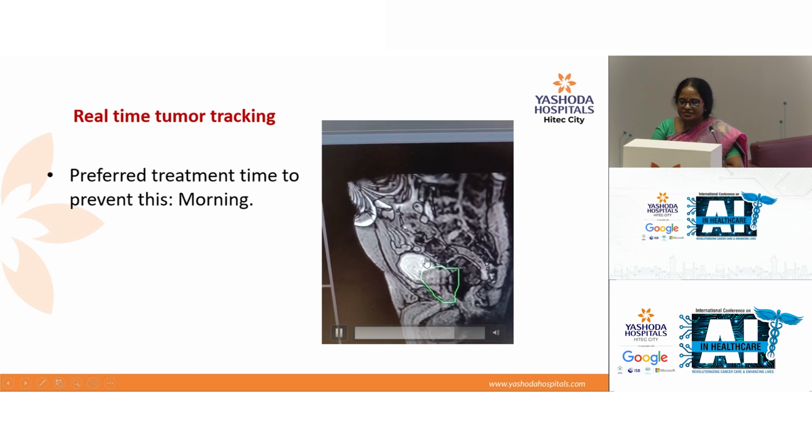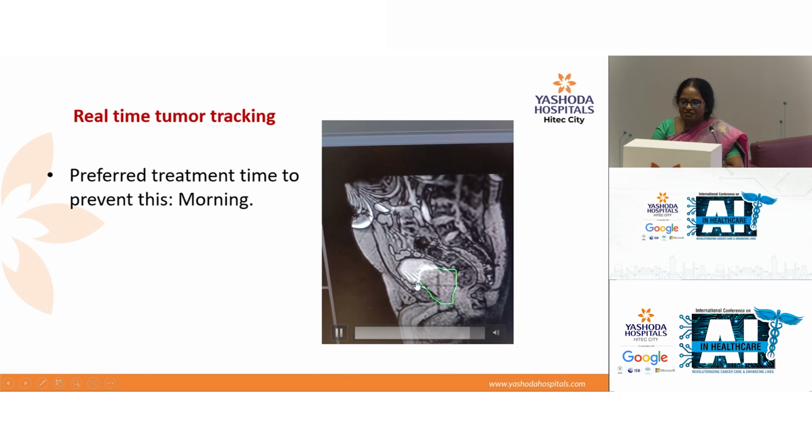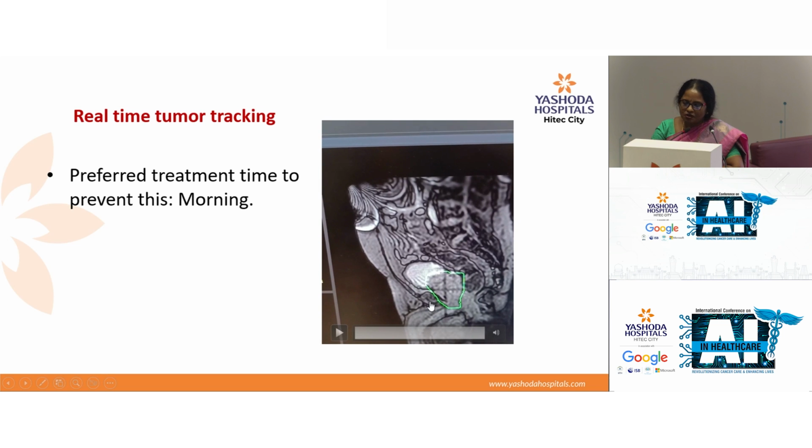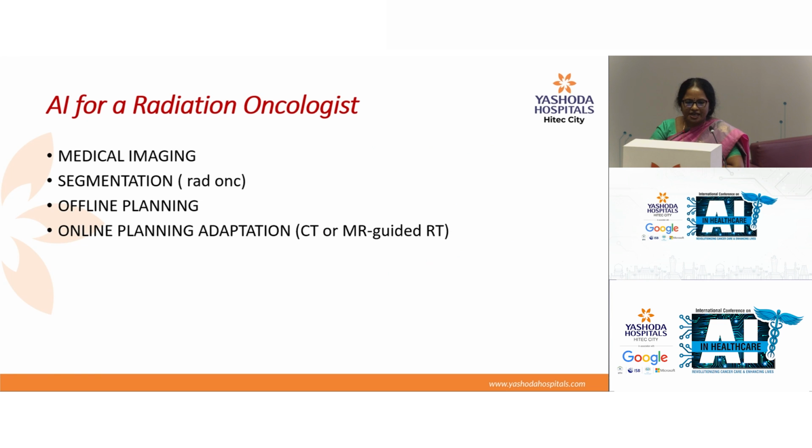But now, since we are seeing the patient during treatment delivery, and we also have the CMM system, which is an automatic system, the moment the target goes out of our boundary, the treatment beam will be switched off immediately. These kinds of precise treatments are happening because of the AI which empowers this machine.